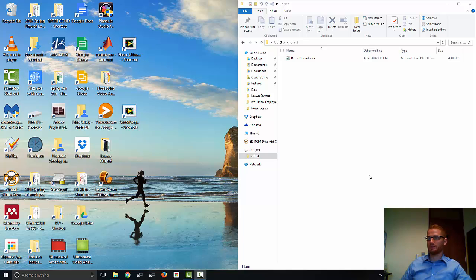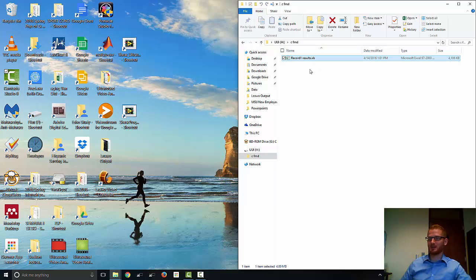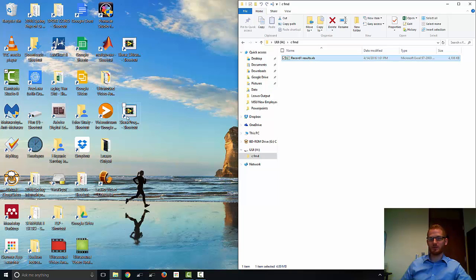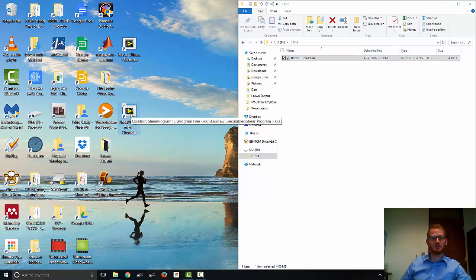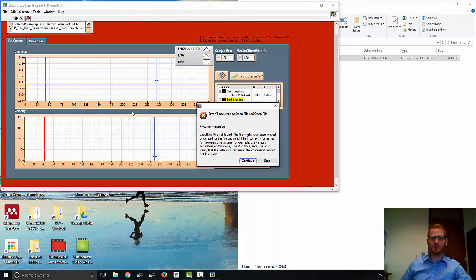Okay, so now what we need to do is take the notepad document, which is showing up as an Excel document because I'm associated with Excel. We need to put it through this program here, which is going to analyze it and get actual FMD values out of it. So we'll go ahead and open this. Unlike the other program, it does not need to be run as an administrator.